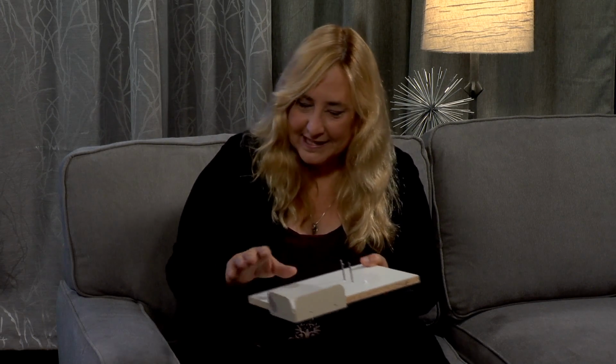Look at this. Now, what's that? It's a torture device from Leslie. I have no clue what that would be. This is a one-handed cutting board. I was actually going to jokingly say a cutting board, because some of those carving boards for roasts have little prongs on them to hold the meat. So this is it. These prongs are sharp, they're nails, so you can poke your food and then cut it. And this is a spreading corner, so you can put bread here, or anything you wanted, like butter or spread.